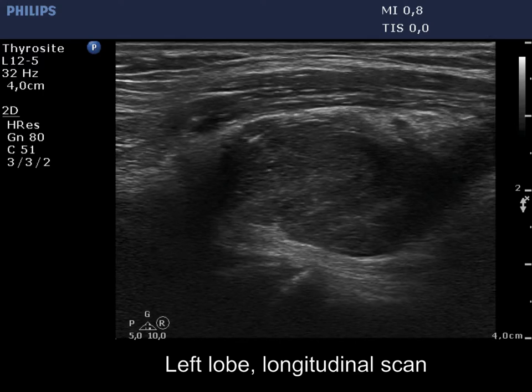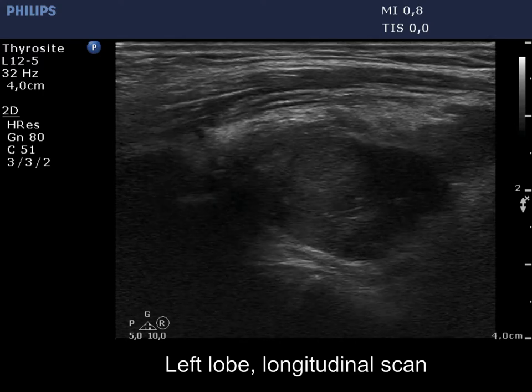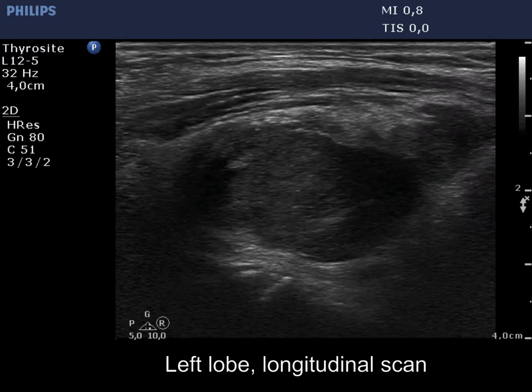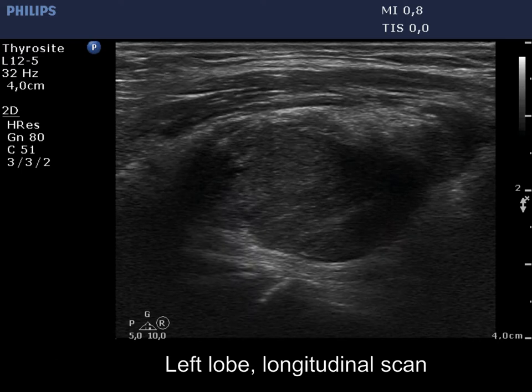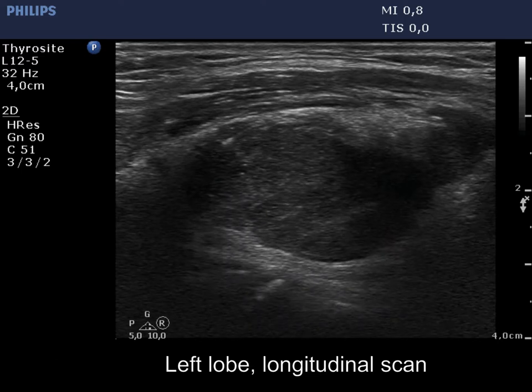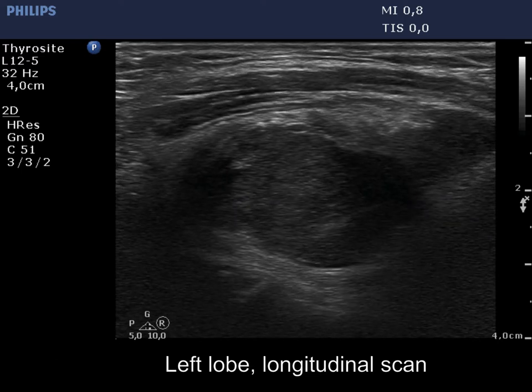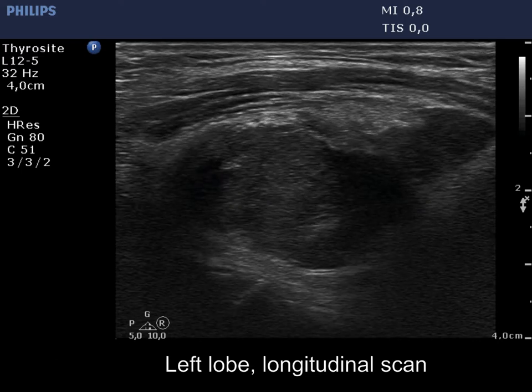The most important help to avoid misinterpretation of this pattern as nodular goiter is the history: the patient was operated on diffuse and not on nodular goiter.